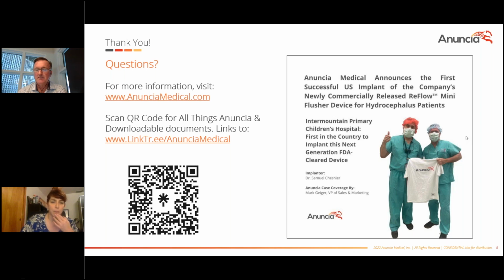We kind of talked about this. I guess I'll just ask it again for the sake of having it asked: how many times can the flusher be flushed, and does it need to be replaced? I guess we did talk about that a little. Yeah, it's been tested to over 100,000 cycles. And how many times it is depressed is as prescribed by your neurosurgeon.